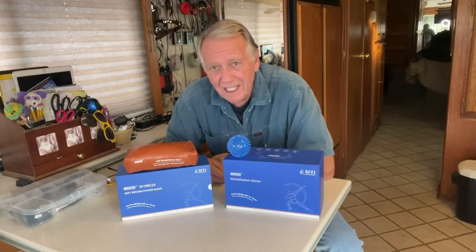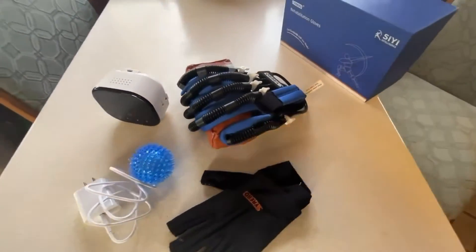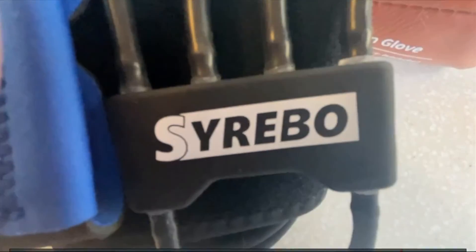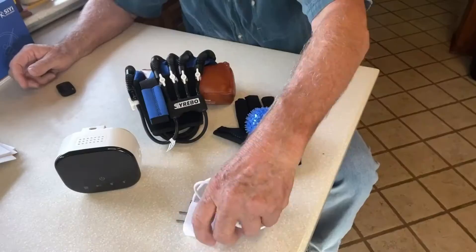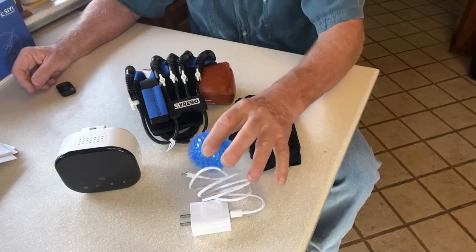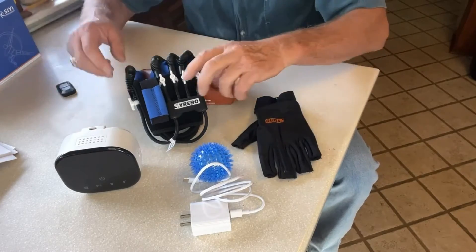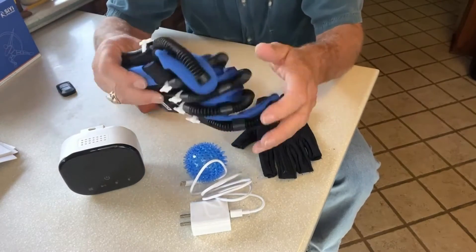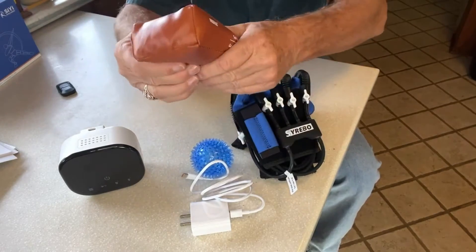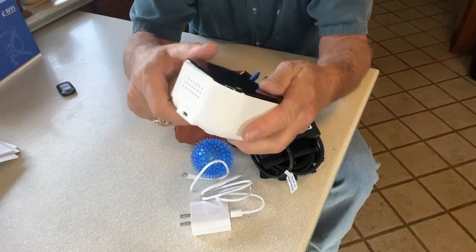This is the nice packaging it comes in. Let's unpack it. Here's what we got: the Cerebo, the power cable, an exercise ball, this is called the data glove, the robotic glove, an exercise cushion, and what they call the host — which is the brains that makes it all work.